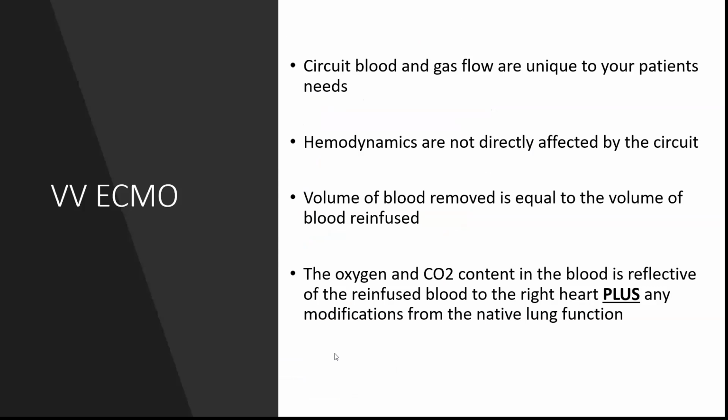So some things about the VV circuit before we talk about the specific parts. Everyone always asks me, what settings do I put my patient on when my patient's on ECMO? And there are some settings we're going to talk about, but what you have to understand is each person is individualized. Like we talked about the DO2, VO2, everyone you put on ECMO isn't going to be at the same ratio. Everyone isn't going to have the same metabolic state. So you have to titrate to the patient. We'll talk about how to do that because each of your patient's needs are going to be unique.